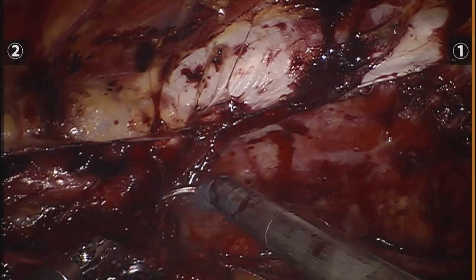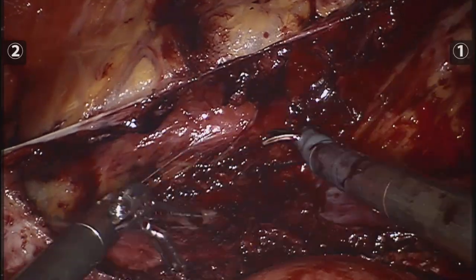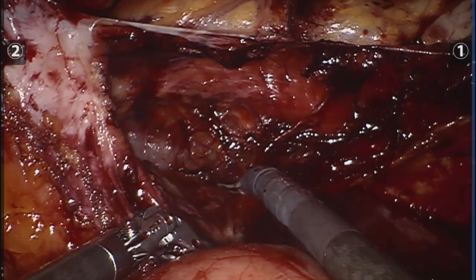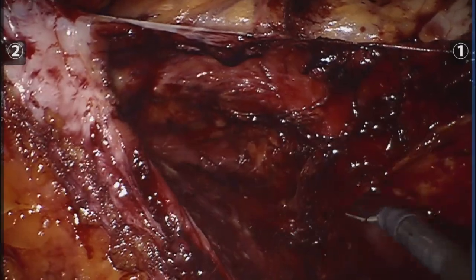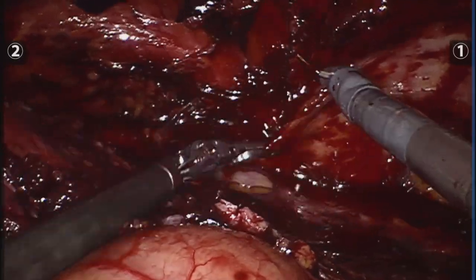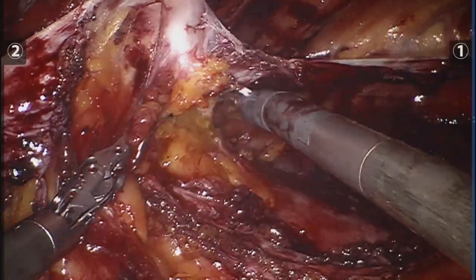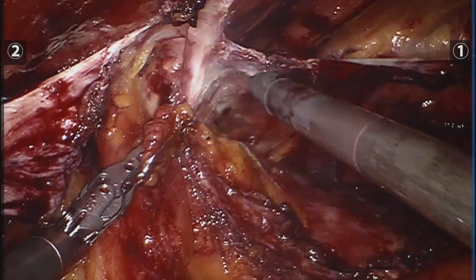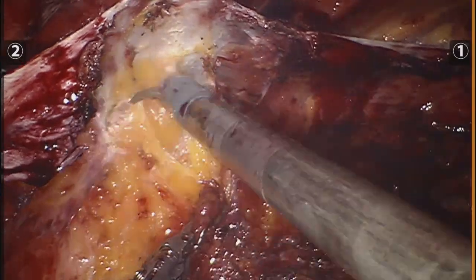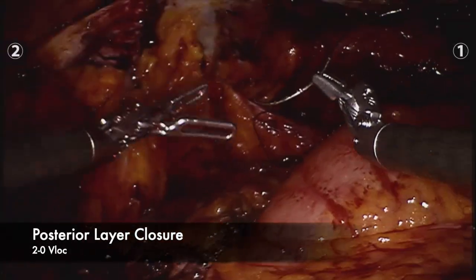Releasing those fibers will finally allow me to release the transversus and complete the dissection so my posterior flap is laying comfortably on top of the viscera. We're just about done on this side and getting ready to do the closure of the posterior rectus sheath in the center. Because of how bloody my operative field got it was a little difficult to see the plane, but I guess that can be normal on the first few cases. We're doing some last dissection in the subcyphoid region to make sure everything is laying nice and flat before we start the closure.